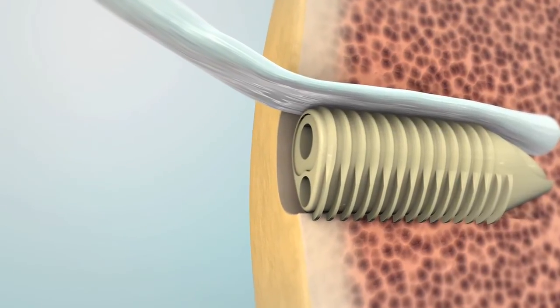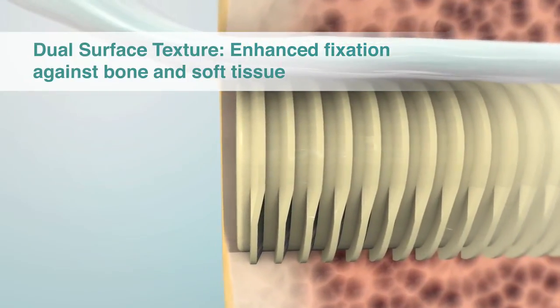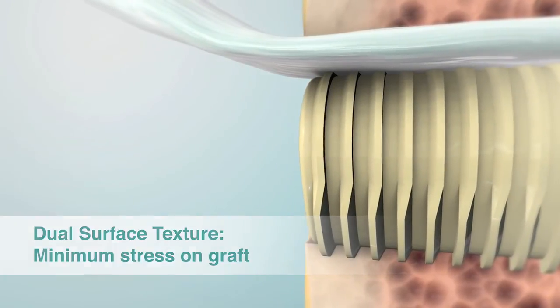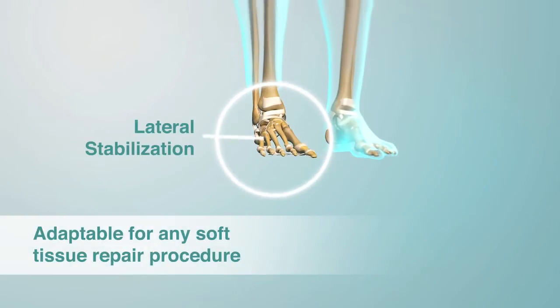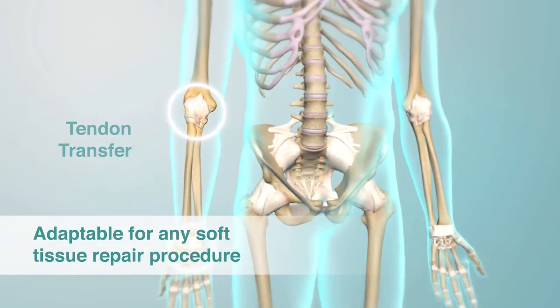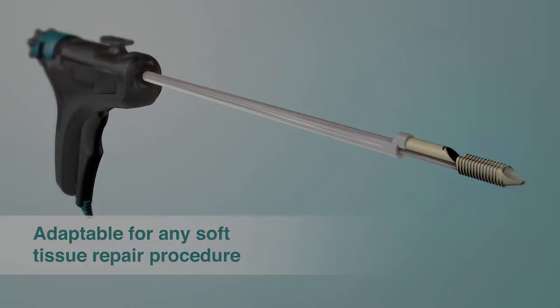The dual surface texture of the sheath provides secure fixation against bone and soft tissue with minimal damage to the tissue. The easy delivery and procedural versatility makes the Eclipse Soft Tissue Anchor the ultimate choice for any soft tissue fixation procedure.